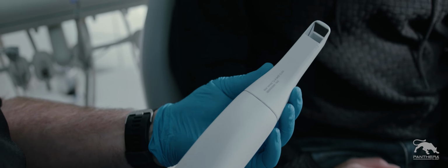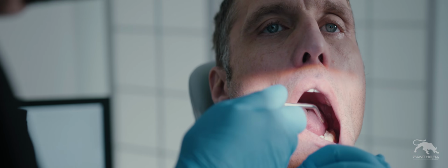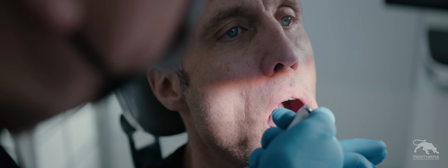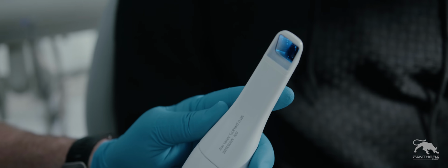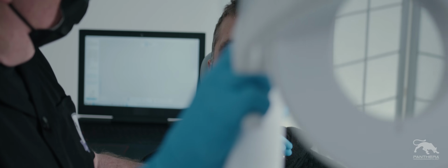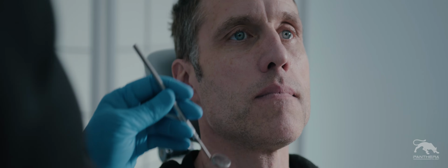Be sure to remove as much saliva as possible from the patient's teeth with an air jet, as saliva drops and reflections can interfere with the result. The optical scanner uses a light beam to capture images. Eliminating direct light sources, such as the dental chair lamp, will prevent artifacts from appearing on the final result.